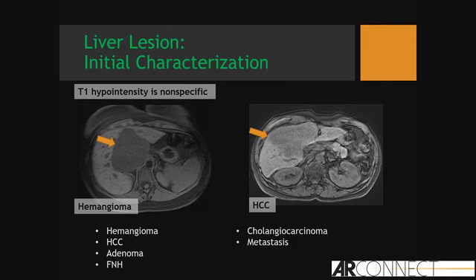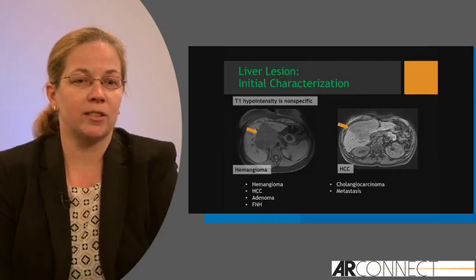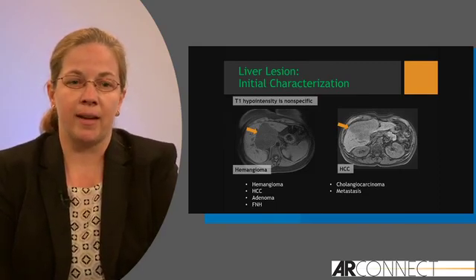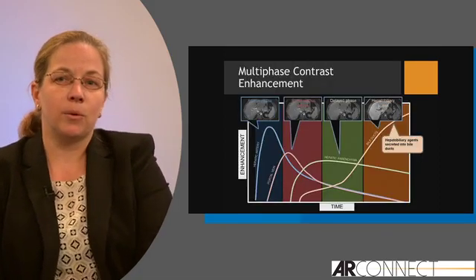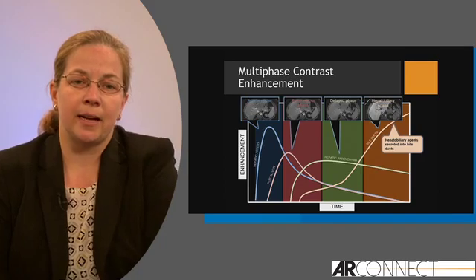So then we switch to our T1-weighted sequences. Can I characterize lesions based on T1 hypointensity alone? No, it's nonspecific. You can have variable T1 hypointensity or marked T1 hypointensity across all characterizations of lesions, be they benign or malignant. So we can't rely on T2 or T1 to help us for lesion characterization.